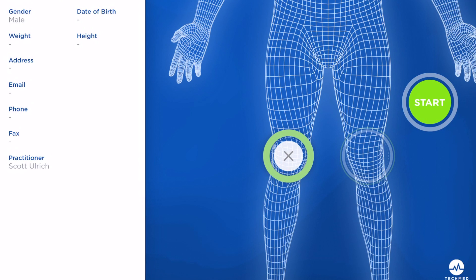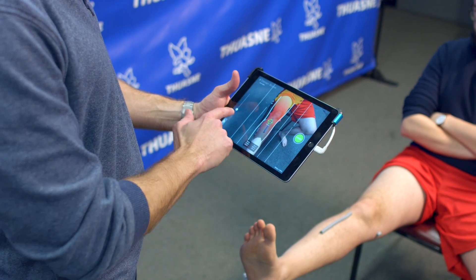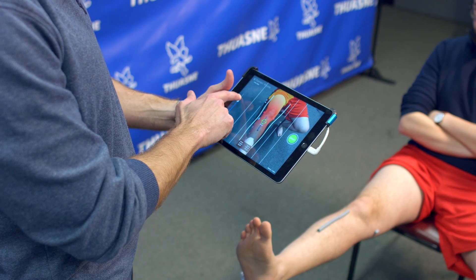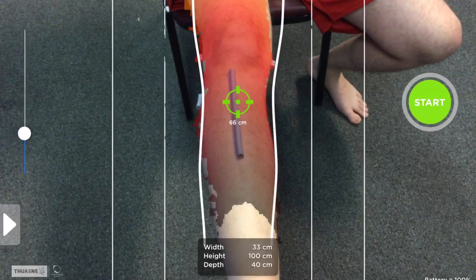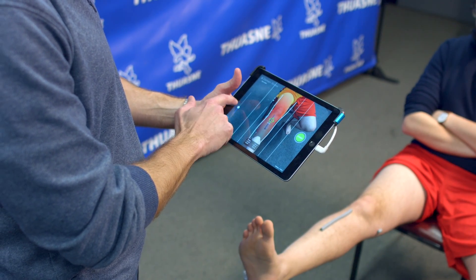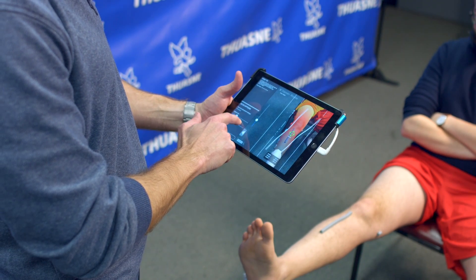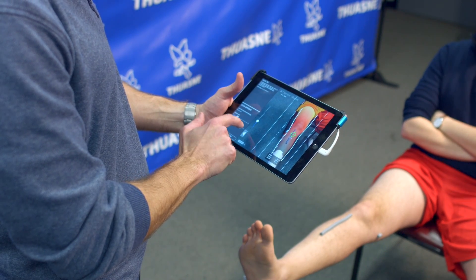Start by selecting the desired extremity that needs to be scanned. The green Start button will now appear. Push the Start button — this will prompt the sizing parameters to appear for whichever extremity you've chosen. You can use the Scroll option on the left-hand side of the screen to dial in these parameters to fit your subject. The app is set to start a scan from a straight-on vantage point, but if you prefer to start on the lateral or medial side, you can change the rotation of your view to that desired vantage point.